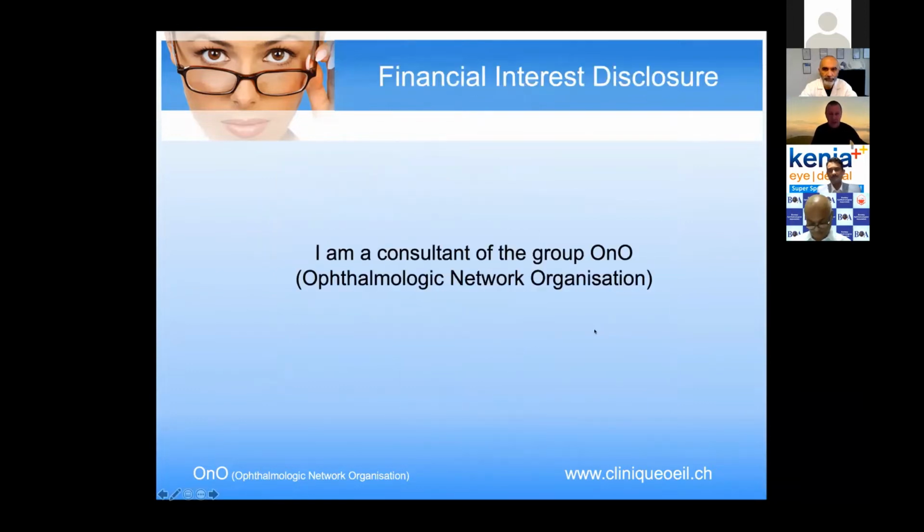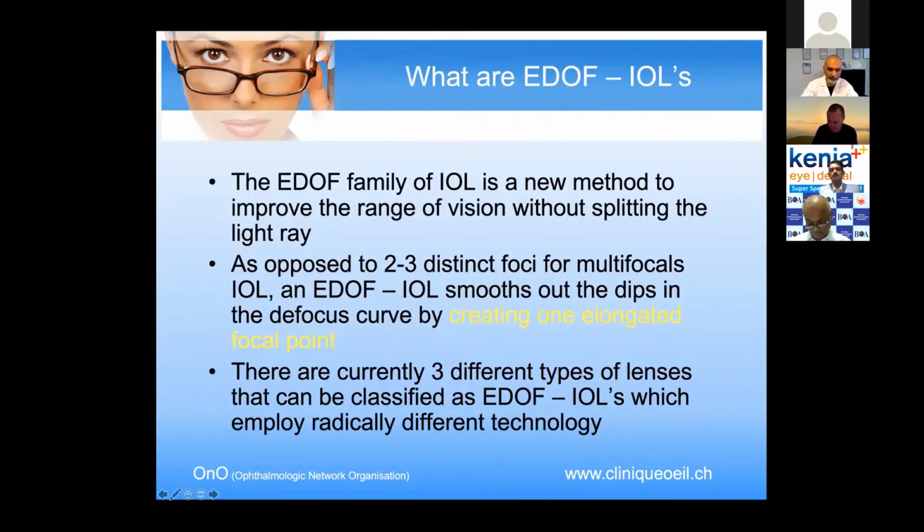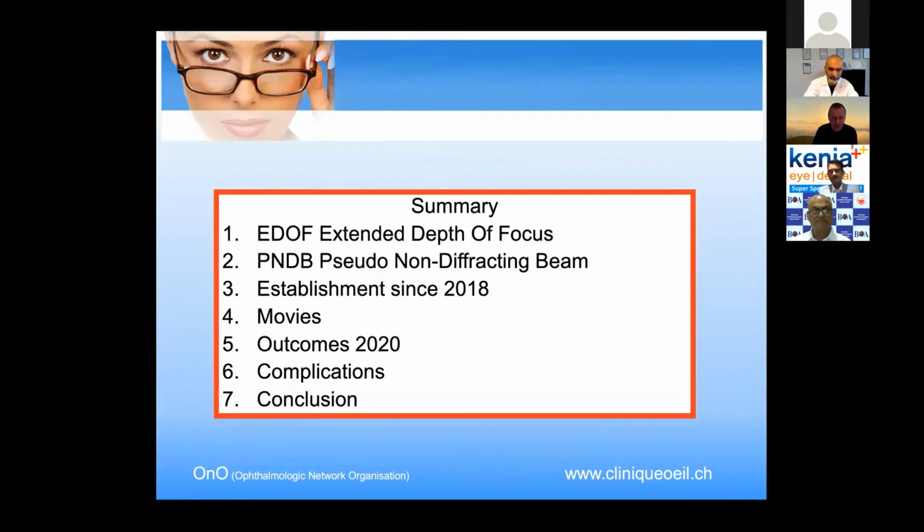So I'm a consultant of the group ONO, and I will start very quick on EDOF, extended depth of focus, and the pseudo non-diffractive beams. We started in 2018. I will show you some of the outcomes from 2020, the complications that we have, and the conclusion.